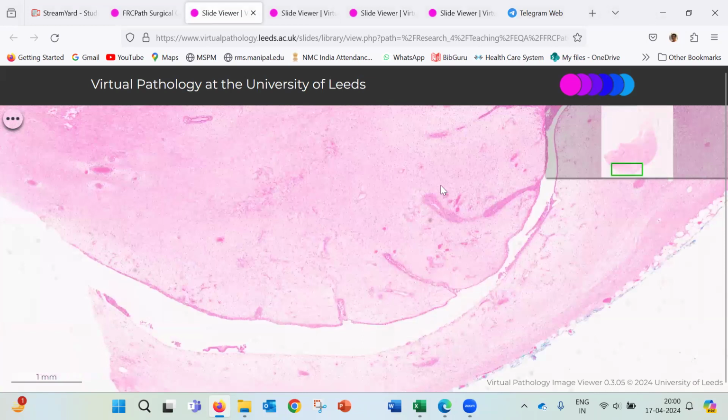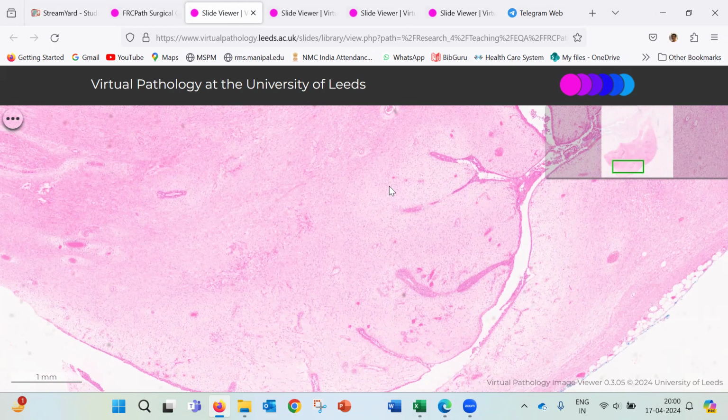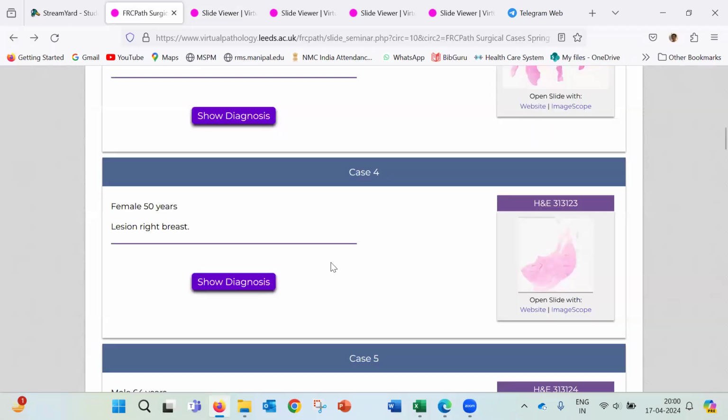So this is how you approach this case, and you say that there is a follow-up protocol, that is atypia, mitosis, the cellular stromal overgrowth, and malignant mesenchymal lesion, known as the Singapore nomogram, particularly for phyllodes of borderline and malignant category, and that is helpful for follow-up for this case. So if you say Singapore nomogram, that will give some brownie points, particularly for this case. So this is how you approach this case 4.